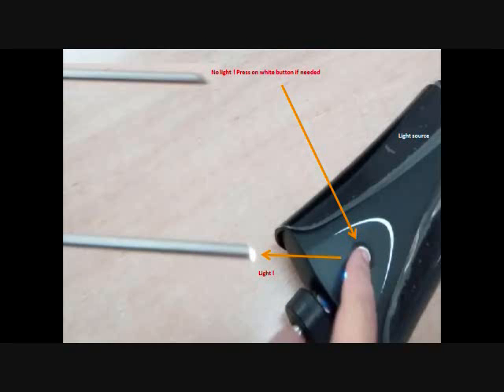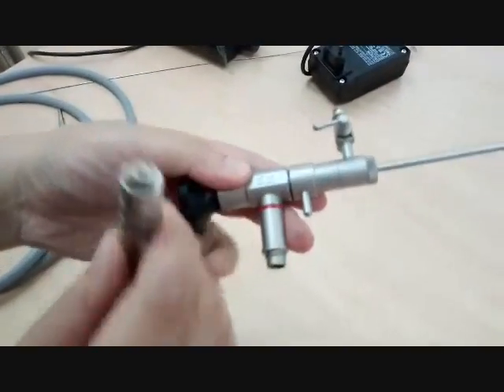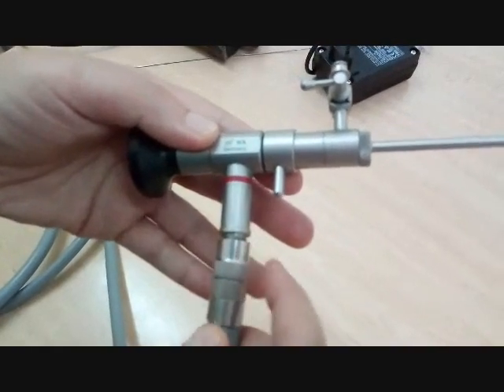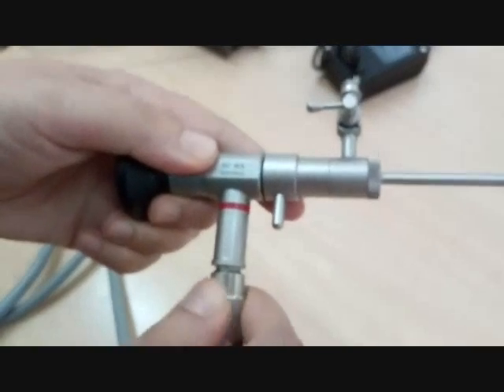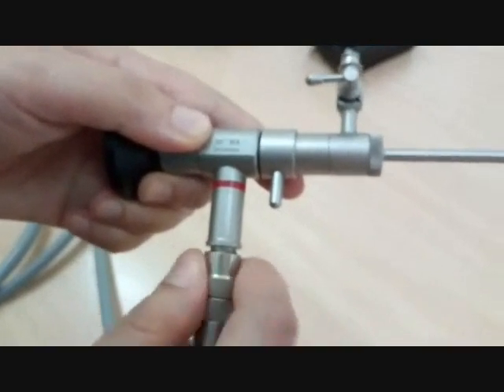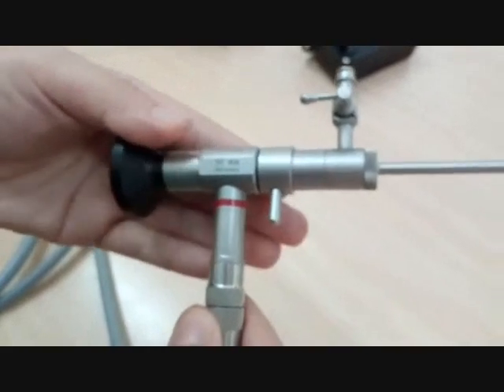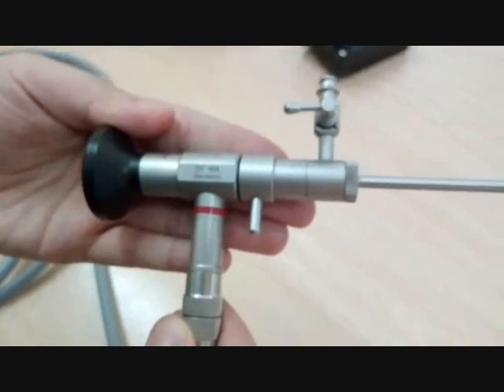And then all you have to do is to press the button on the light source to have light. You press it again and the light is off. A little demonstration will do good. Here's a scope in its diagnostic sheath, and here's the light cable. We screw the light cable to the scope thanks to the superior screw, only the superior screw. We lock like that. There, it's done.